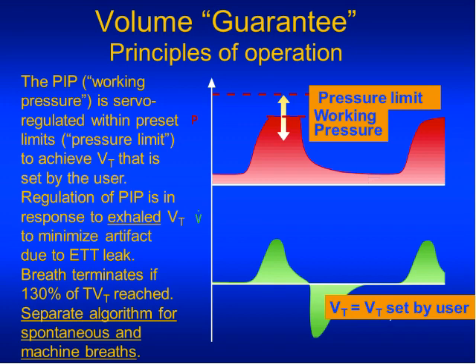And it uses the exhaled tidal volume of the previous inflation. And it does that because, as I'm sure you appreciate, leak around the tracheal tube is more during inspiration. You can hear the whoosh during the inspiratory phase. And therefore, the exhaled tidal volume more closely reflects the actual inspiratory volume. So that's all good, and that's in essence how it works.